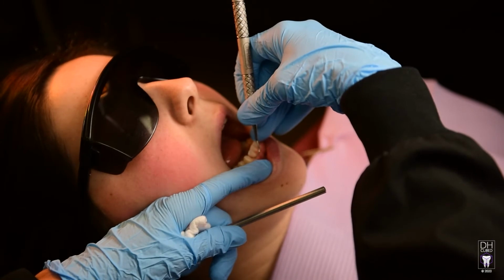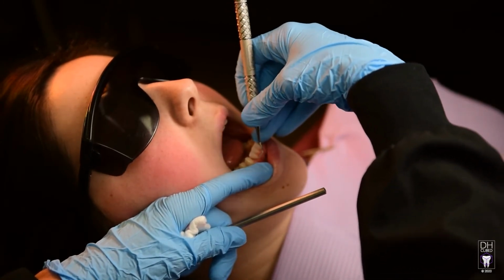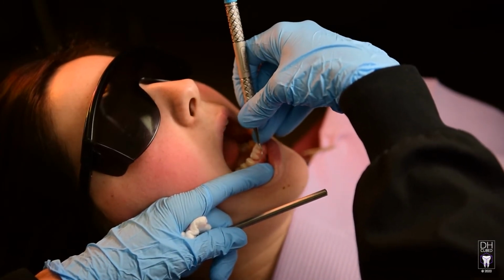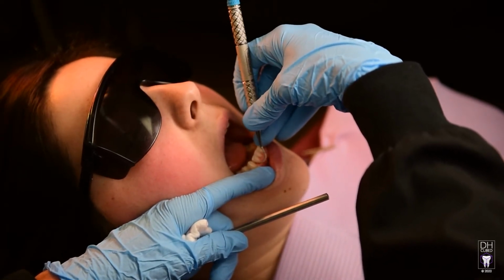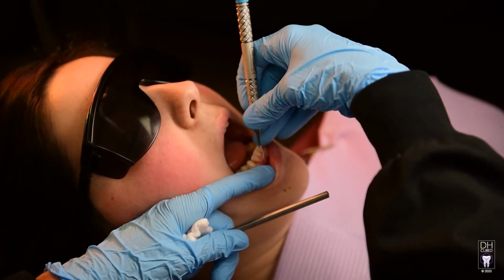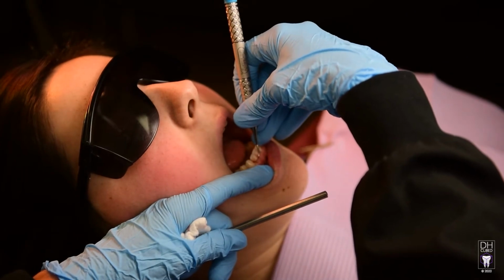In review, a sharp instrument allows for a lighter working stroke, leading to healthier hands. Notice how the hygienist is working with ease and very little pressure. It takes less working time for complete debridement, giving the patient the best care, and it allows for patient comfort, giving the patient a sense of a light-handed hygienist. There's less tissue trauma, leading to faster healing and little to no pain.